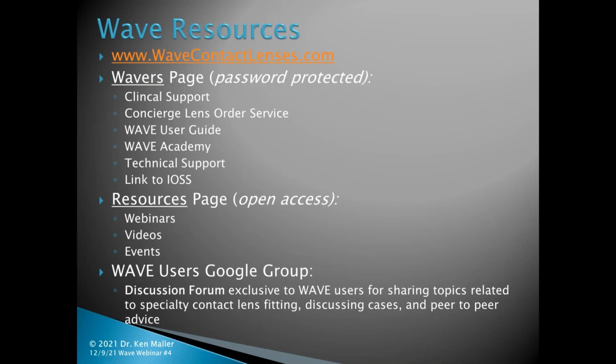Perfect. That makes a ton of sense. And I feel like that might be a similar answer to our next question, which is, why did you choose to average the astigmatism in case 3? Why did you choose to average the astigmatism data in case 3, as opposed to just using the raw data? You mean the peripheral astigmatism? Correct.